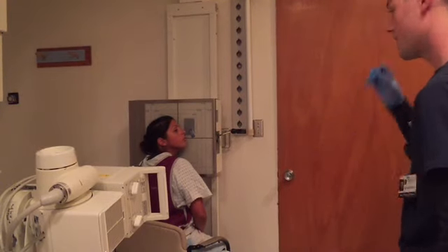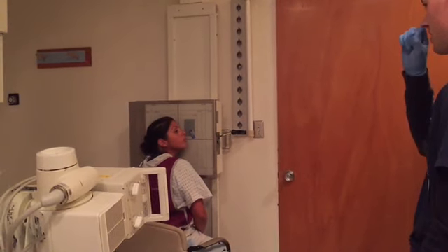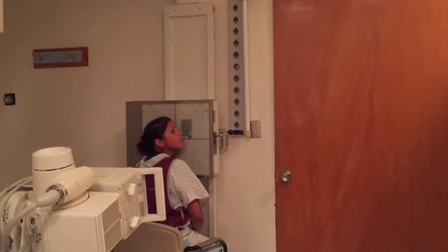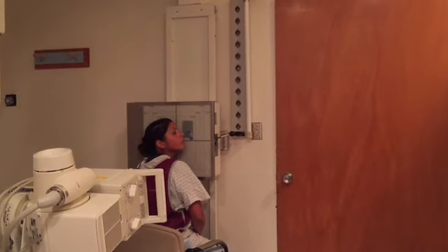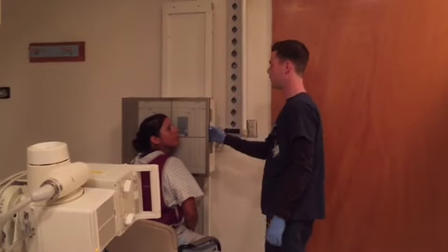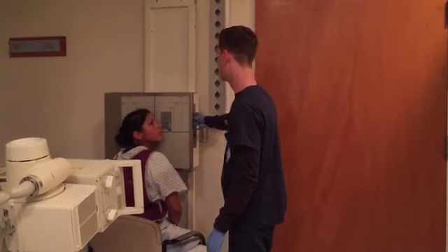And drop the technique a little bit. I'm going to probably use about 75 at about 8 to 10 mAs again. Okay, Evelyn, go ahead and hold your breath and don't move. Expose. Alright, go ahead and breathe. Move my cassette, run it, bring in another one.